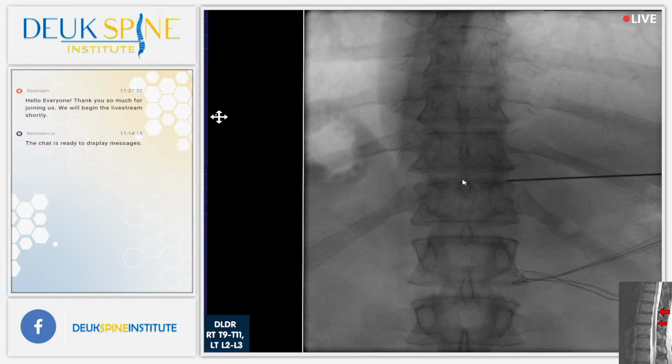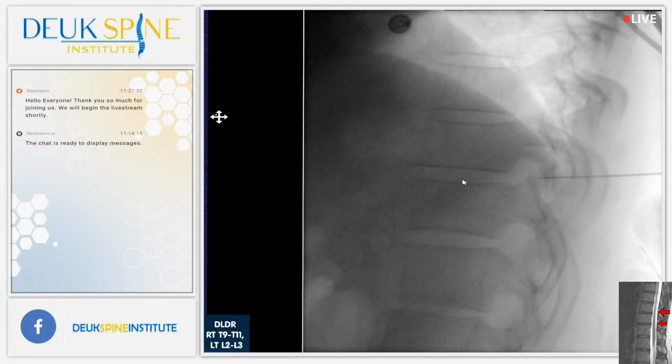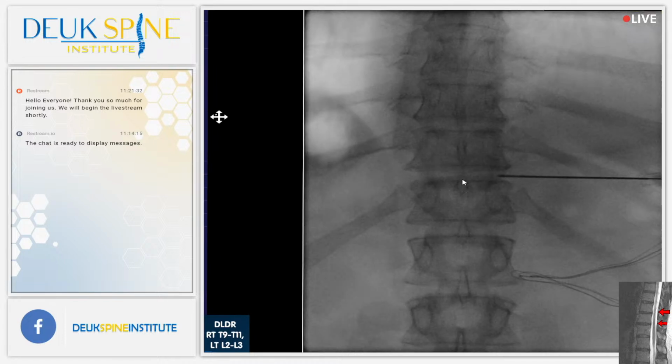So I always want to start medially and then work my way a little bit lateral to improve my trajectory. There we go. Shot. Shot. Shot. So this is good. Shot. We're around it, like I said. Now, let's get one more AP and verify. At this point, remember, we have only 11 ribs, so it's going to look like we're at the 11-12 disc, but we're actually at the 10-11 disc. So perfect. It's perfect. Look where the needle position is.